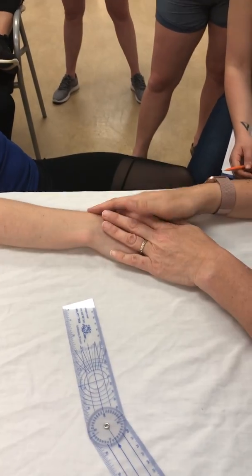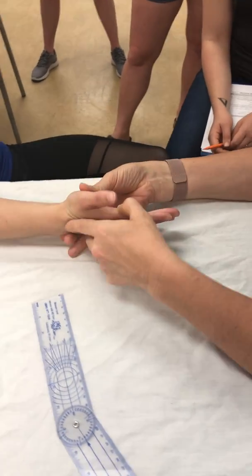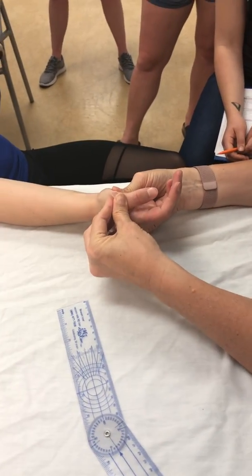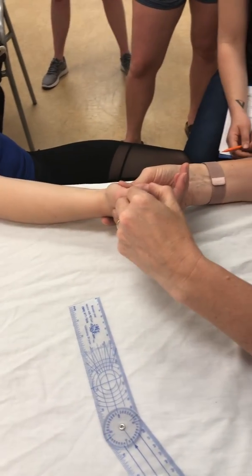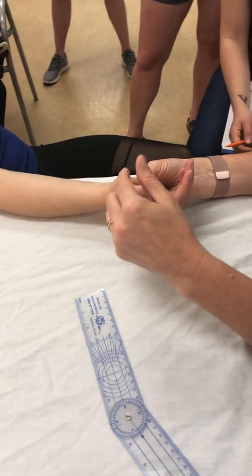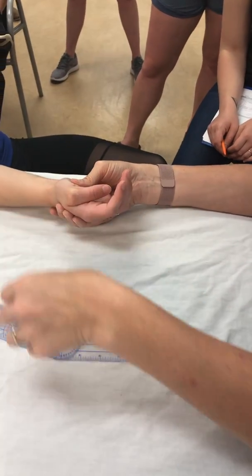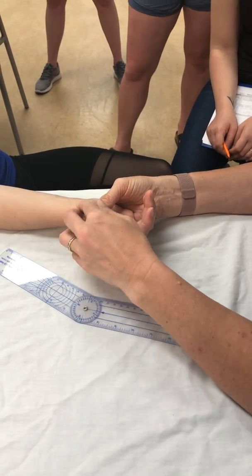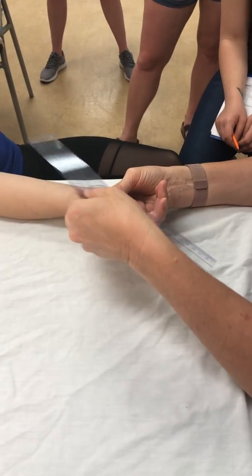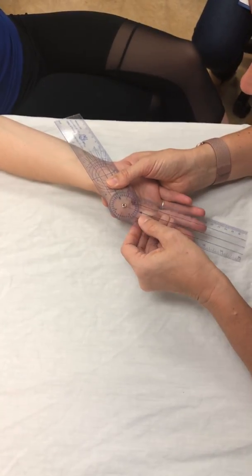The other one that I had questioned, so those are all of our thumb motions. Now I'm sorry, I'm gonna flip you back over. For the MCP joint, so the metacarpal phalangeal joint is going to be that first knuckle, and then we only have one interphalangeal joint of the thumb. Again, think about sticking the goniometer, a pin through here, as an axis for the motion. So if we want to measure MCP flexion, we're going to put our stationary arm on our proximal segment and our moving arm on the distal segment.